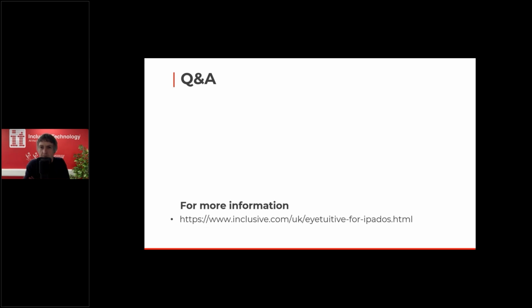Just time for one more question. Let's have a look. How good is the eye tracking outdoors in the sun? Would the tracking accuracy be affected? That, interestingly, is something we have very little experience in at the moment. Maybe now we've actually got some sun here, I can certainly try that and let you know about that.